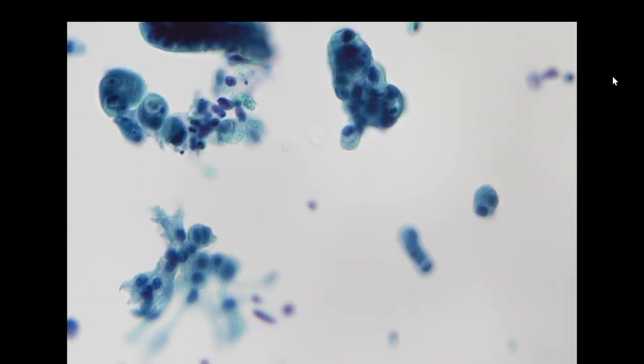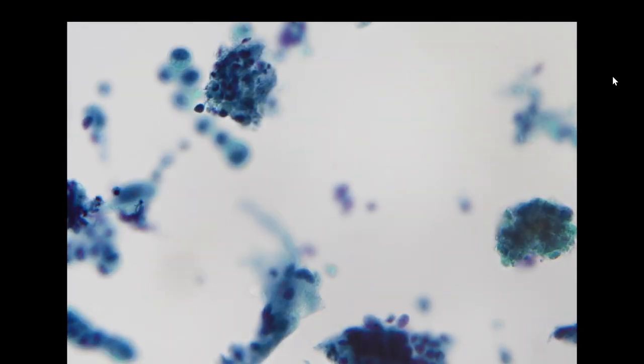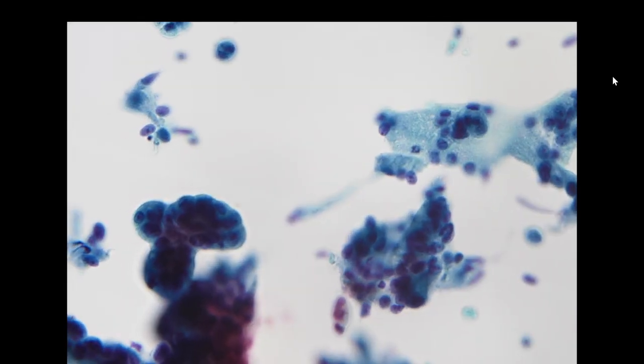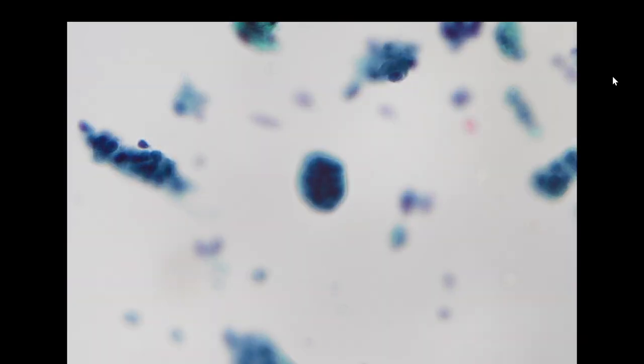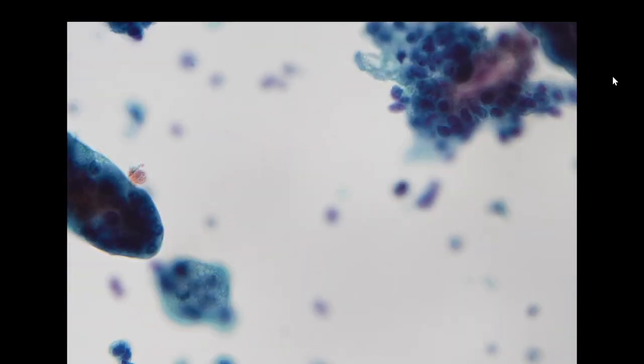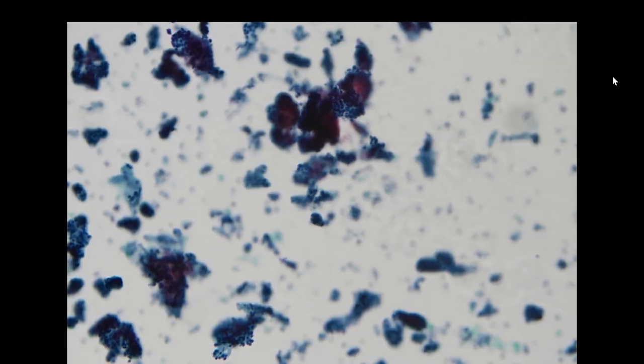Because we have a lot of cells in our specimen, we will usually try to navigate for the primary, at least so the clinician can send the patient to the right department. When we have a specimen with this cellularity, we would usually think it may have some residual lesional cells in a cell block.